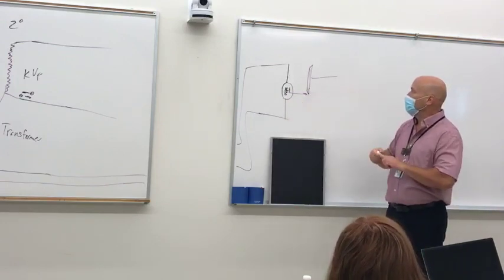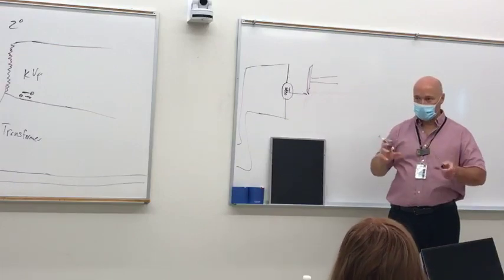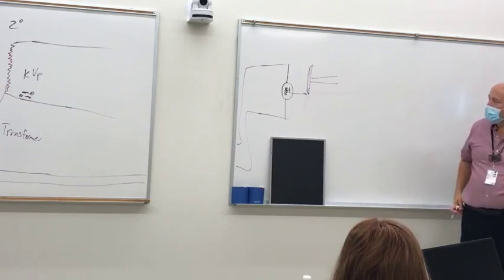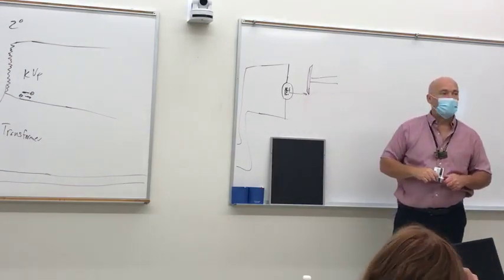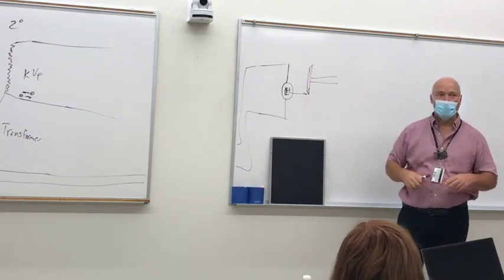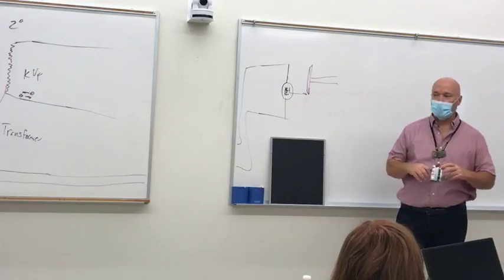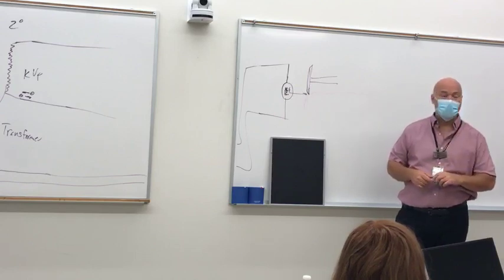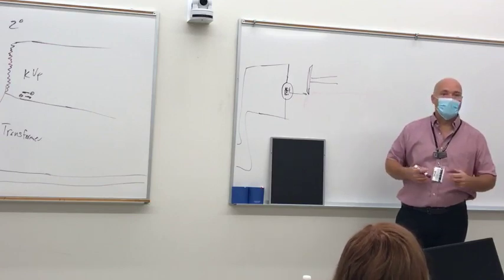At the same time, y'all saw this end of the tube where it would spin if you turn the tube. That starts to spin. The reason it starts to spin is because this is just like a light bulb. What happens with a light bulb? You flip a light on, and I'm not talking about a fluorescent light or an LED light. An Edison bulb. It gets hot, right? You reach up and touch it after it's been on for a while, and you're losing fingerprints, right?